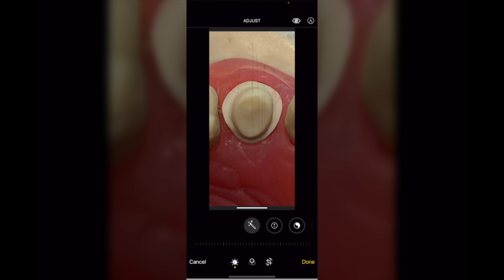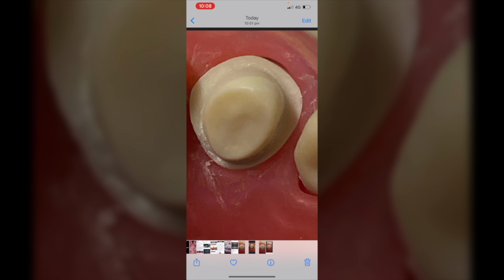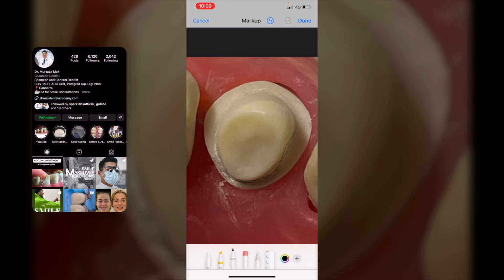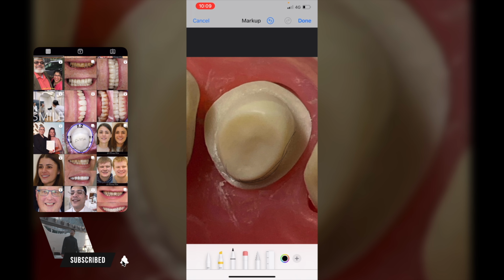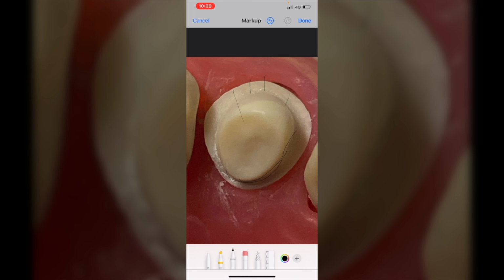That is number one. If I go to the second photo, which is this one, the other area that you'll be able to assess is a lot of shadowing. Now, when you get a lot of shadowing around the margin, especially in this margin here, this suggests that you have an undercut running through. Whenever you have a deep shadow like that, there's a high chance that you have an undercut. So maybe your burr placement was not correct. Another thing which is very visible, the margin is less than 1.2 here.